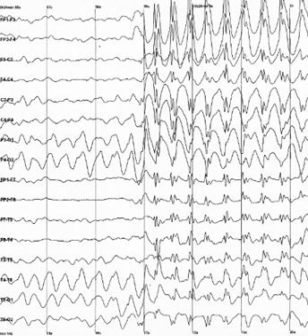Most EEG systems these days, however, are digital, and the amplified signal is digitized via an analog-to-digital converter, after being passed through an anti-aliasing filter. Analog-to-digital sampling typically occurs at 256 to 512 Hz in clinical scalp EEG. Sampling rates of up to 20 kHz are used in some research applications.